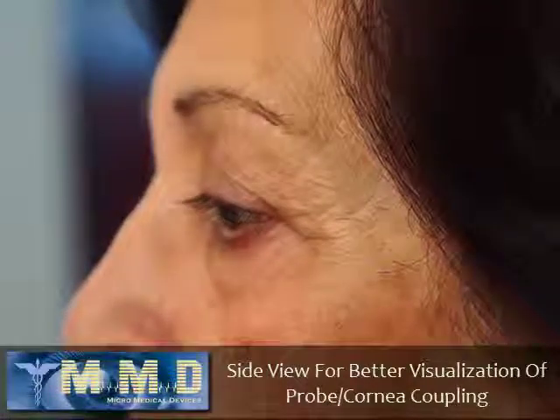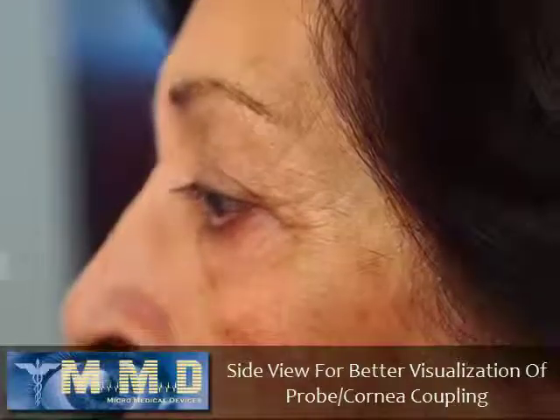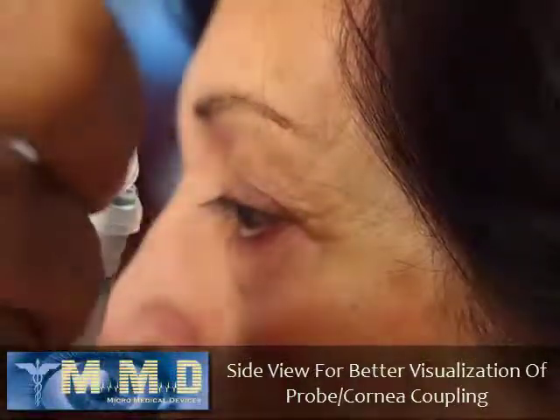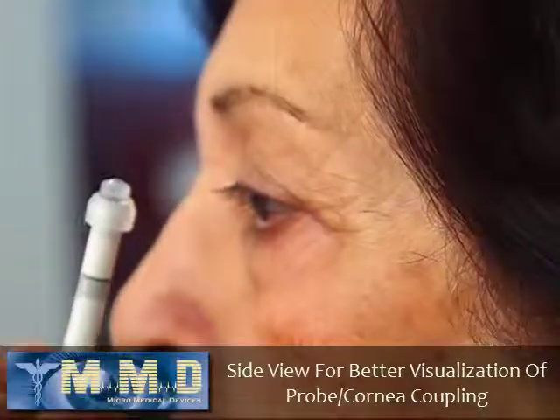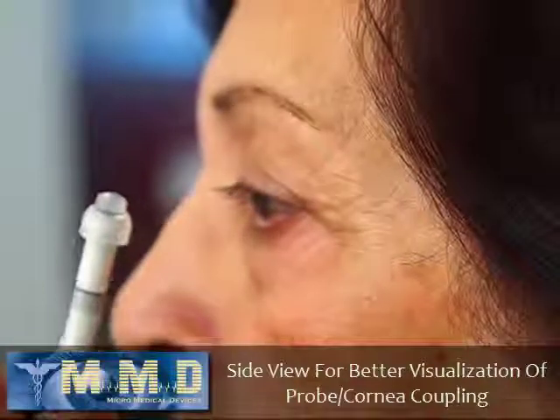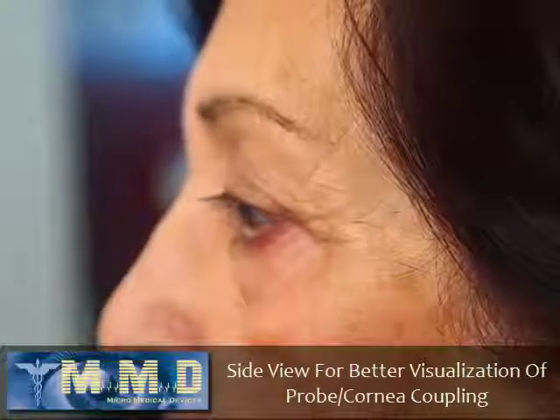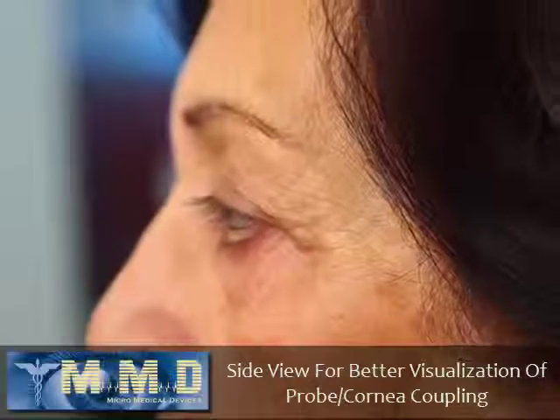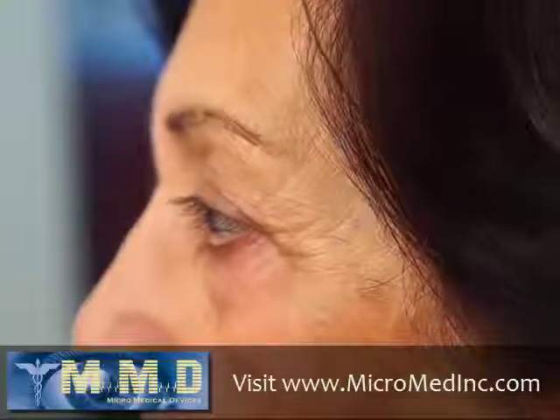Now that we have successfully scanned the right eye, we're going to scan the left eye. And to do that, I will reintroduce half of the drop that was lost to the right eye back into the meniscus on top of the EZ immersion. And at this point, you're ready to scan. So you press the scan button. Make sure you're in immersion.